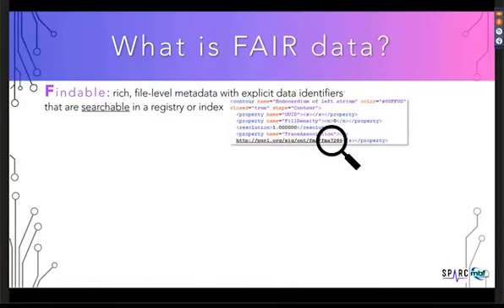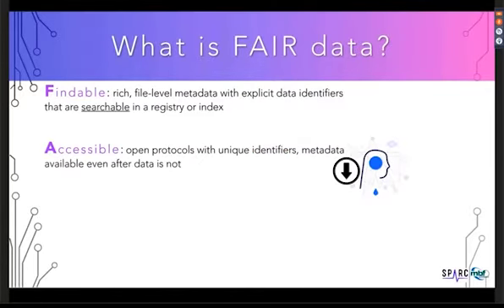Because we have built-in API access to the SciCrunch vocabulary databases within NBF software applications, we are able to write unique identifiers to the data file for each contour that was segmented. For example, here, the endocardium of the left atrium has an FMA ID of 7286. This ID and the entire URL to the parcellation where the term is cataloged is findable to both humans and computers.